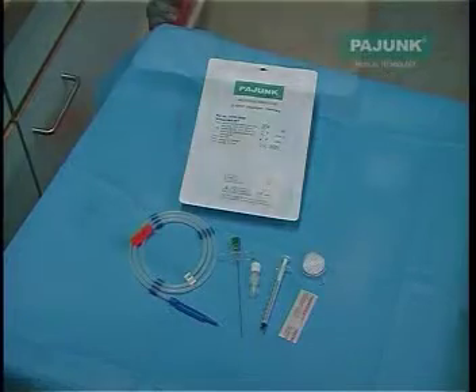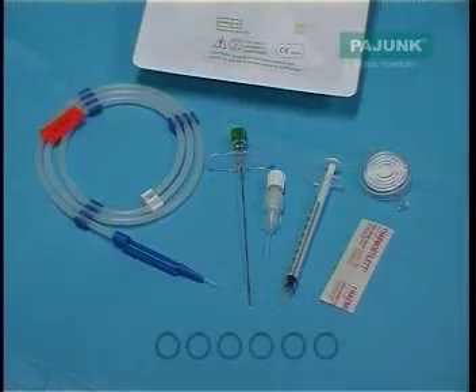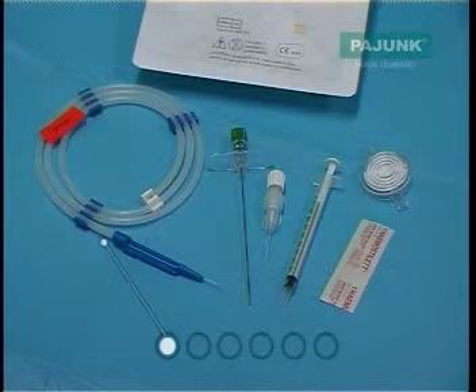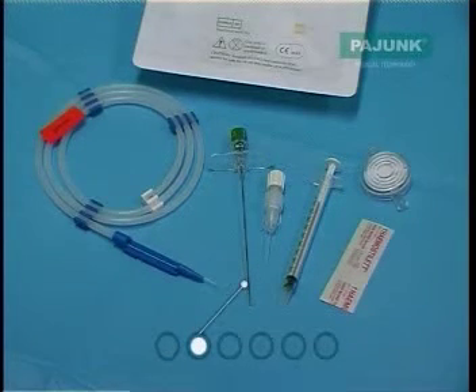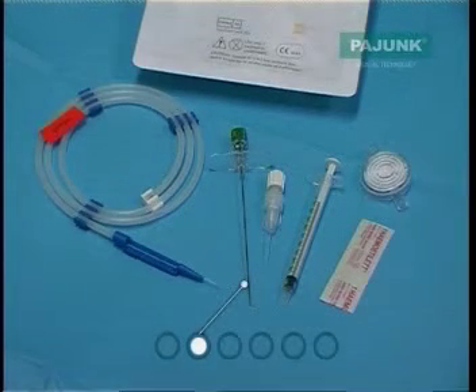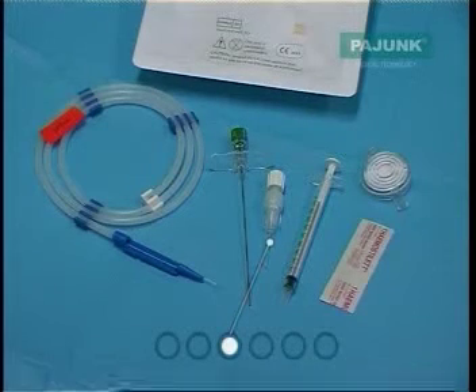This is the Pajunk Intralong spinal catheter set. From left to right, we have a 25-gauge spinal catheter, which contains a guide wire and is presented on a spiral cassette. Next to this is a 21-gauge special Sprotte needle, which is 9cm long and has centimetre gradations marked on it. Beside this is a standard Tuohy-Borst catheter connector.